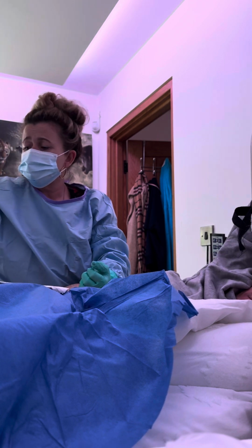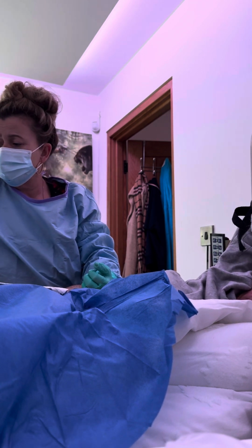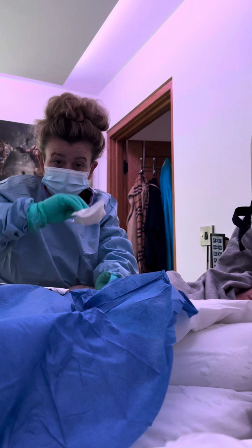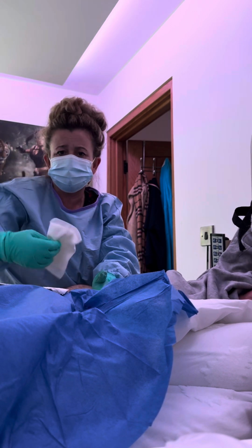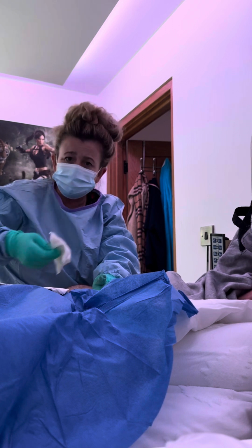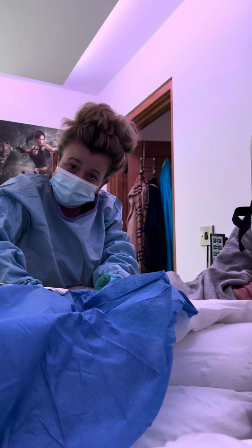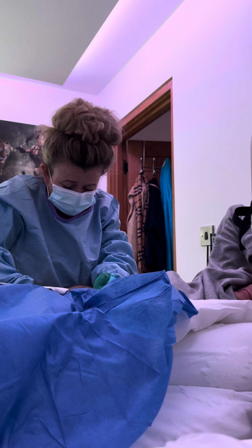So I've got some saline, so what I'm going to do is give it a wipe with some saline. You be really gentle and you only sweep around the area once, and you sweep around the other area once. You do not cross-contaminate it.